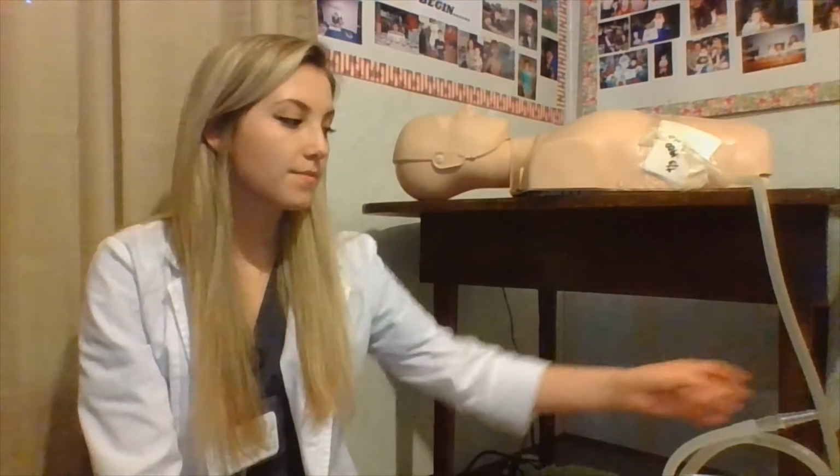You also want to ensure that your tubing is free of kinking and clots. So you just go along the tubing like so. Do not strip it, but just look at it and make sure there's freely flowing fluid coming out of the patient. You also want to ensure that your connections are sealed. We have an airtight dressing, so we're good to go. We could check the drainage system and make sure that the tubing is connected safely to that as well.